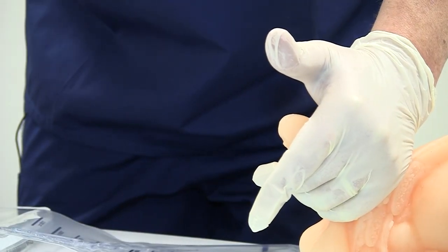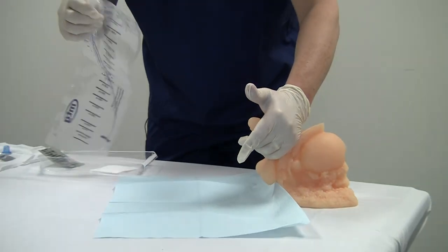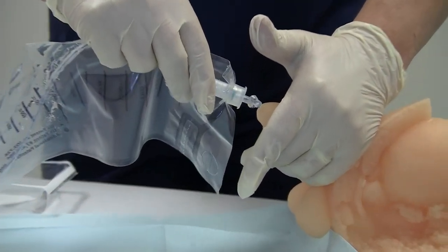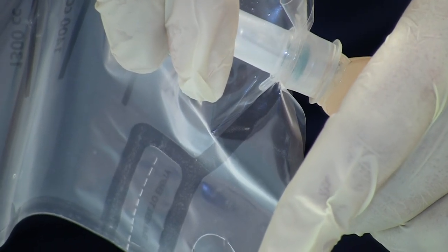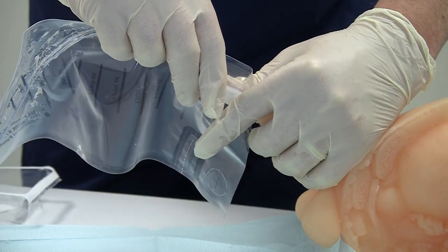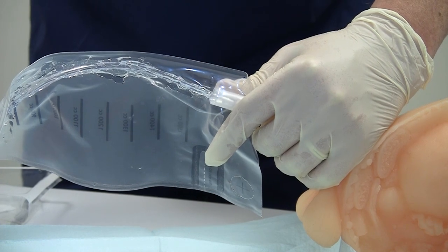Now once we've prepped, without letting go of the patient, I'm now going to reach back for our catheter. And again, it's all pre-lubricated. I'm going to insert the catheter and the introducer tip in the urethra just like this. It should look just like this in the patient as it does in my hand and my model here. And now, my thumb and my index finger I'm going to use to just stabilize everything so I can let go of the patient with my right hand entirely.